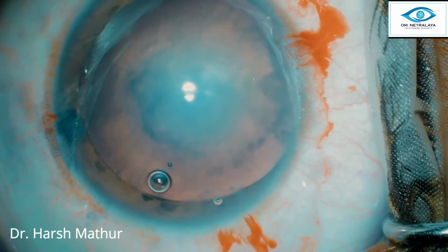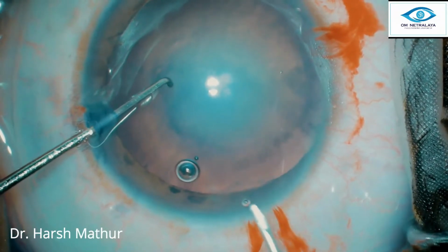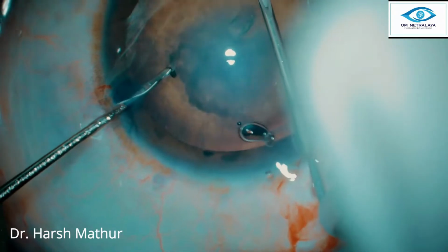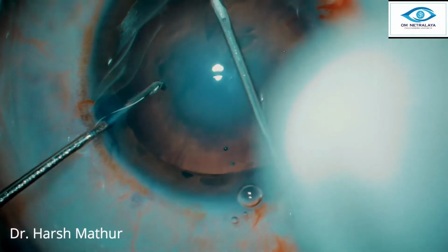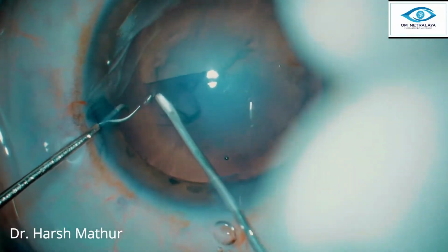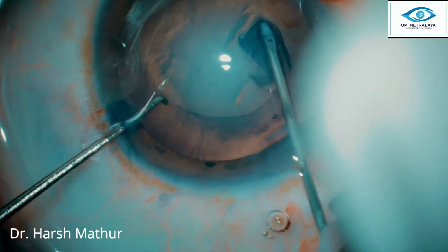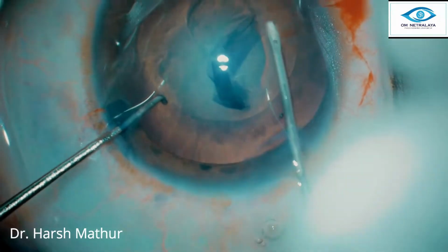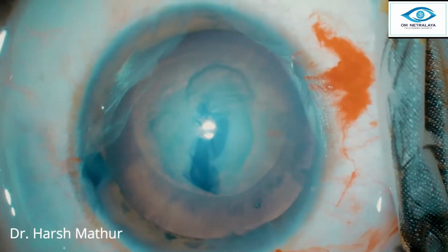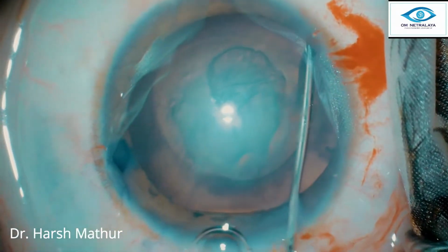So by now the side ports are made and the main incision, a triplanar incision, is made. Now is the time to make a capsulorhexis. So I am aiming around 5.25 to 5.5 mm of rhexis. So we have got a fairly round rhexis, and now is the time to do hydrodissection.